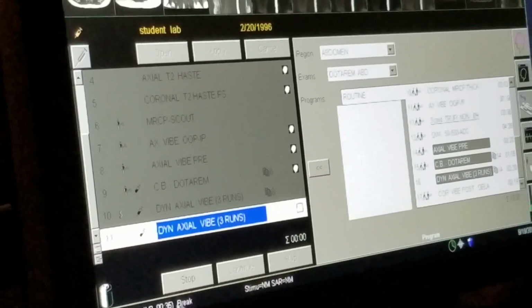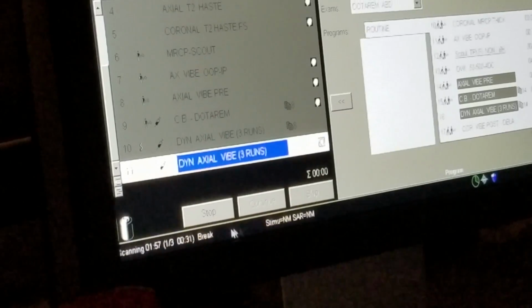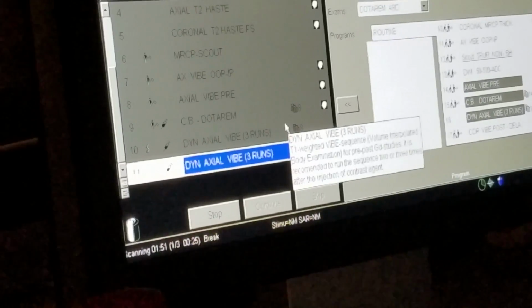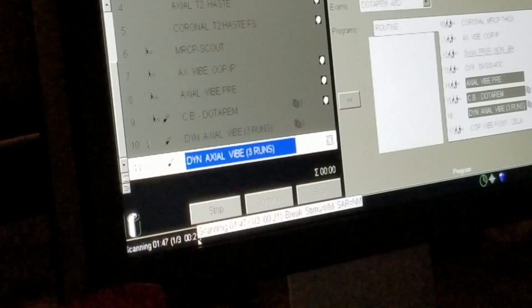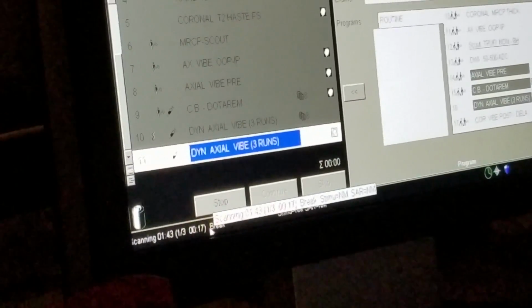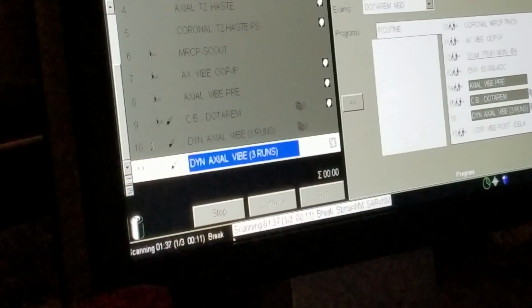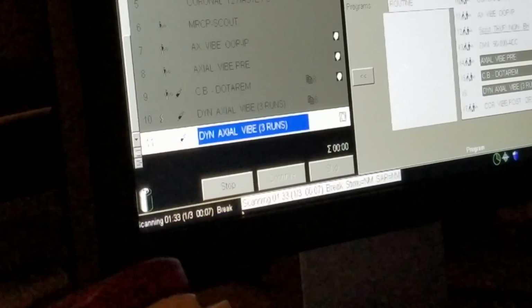And now at this point, you see it already ran the first of 3 measurements. It's got 30 seconds before the scanner will start. The scanner is going to start on its own. You're actually not going to touch any more buttons. So when this clock, do not get distracted, do not divert your attention anywhere else. Keep your eyes right on this clock. So when it gets to be about 6 seconds, I'm going to say take a breath in and hold it. And the scanner is going to start on its own when it says 0.